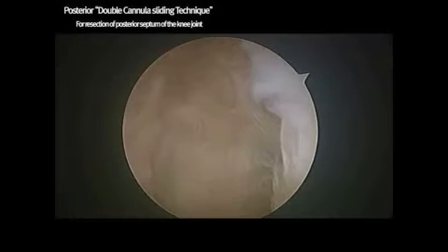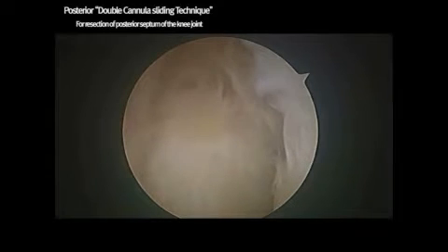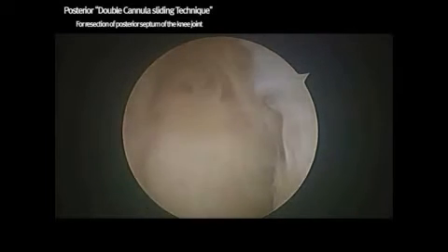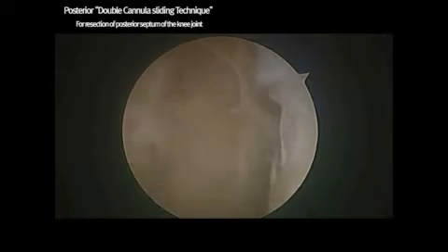The patient was placed in supine position and the right lower limb was prepared in a routine manner. First, the arthroscope is introduced into the posterior-medial compartment through the trans-notch approach from the anterior-lateral portal.